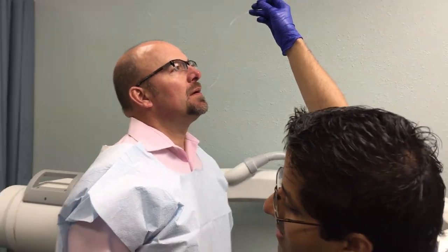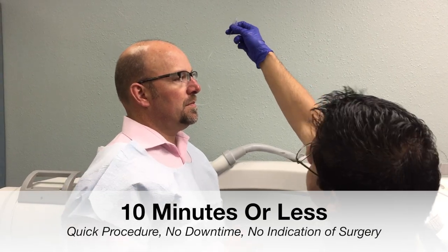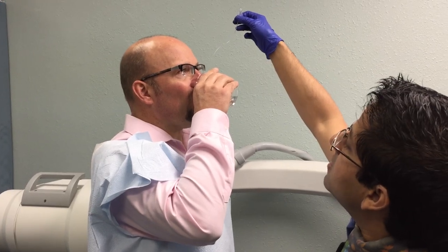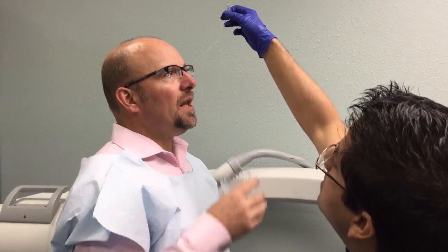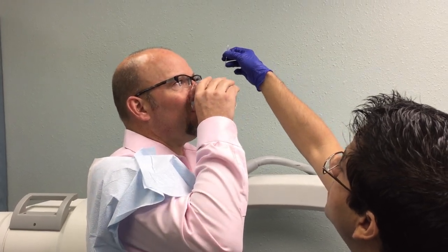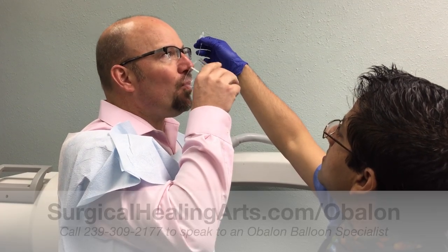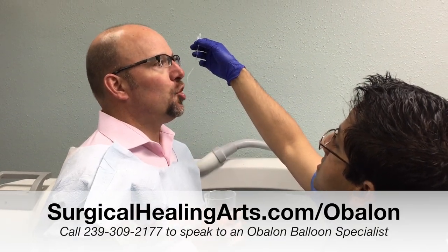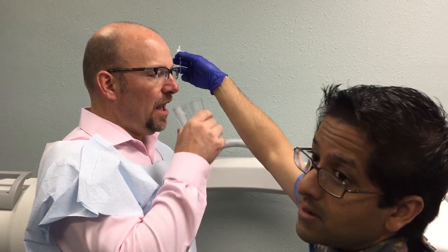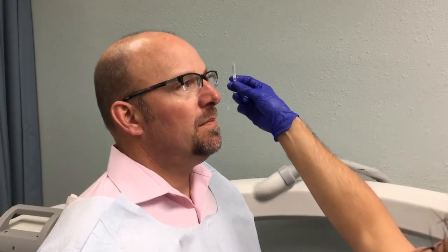Hand me that and I'll take the other glass. Take this in your other hand, mouthfuls and keep drinking. Forceful swallows, turn the catheter back into your mouth. There you go, keep on doing it, it's traveling very well. You're doing fabulous, almost there. Wow, awesome, fabulous — that was a big move! Keep going, it was a great move, it's almost there. Good job.